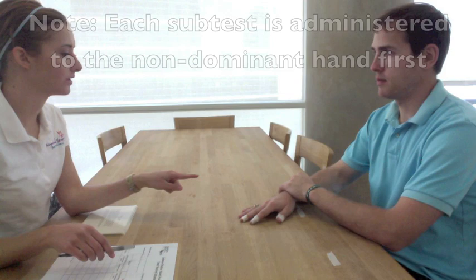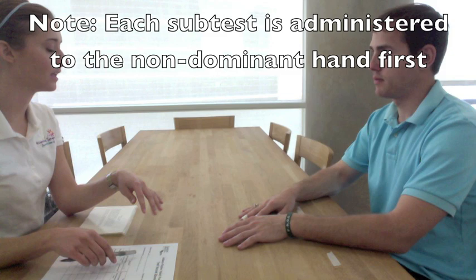'Have you noticed that changing the way that you do any activities?' The patient responds: 'I've noticed a loss of sensation in these three fingers.' The therapist explains: 'Today I'd like to do the Jepson-Taylor hand function test with you. It has a series of things that we'll do, and we'll start with your non-dominant hand, so your left hand, and then we'll do your right hand afterwards.'